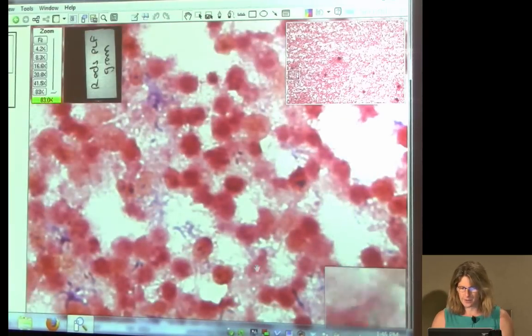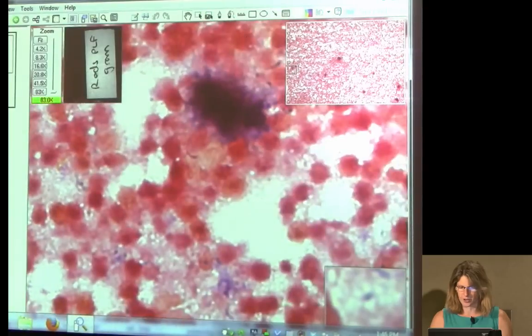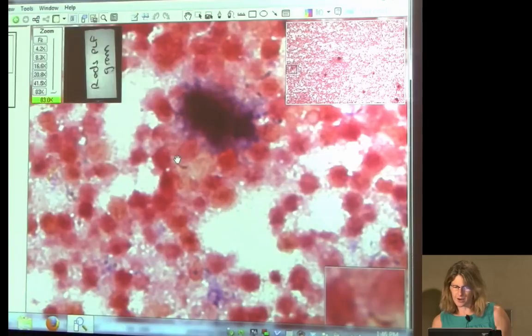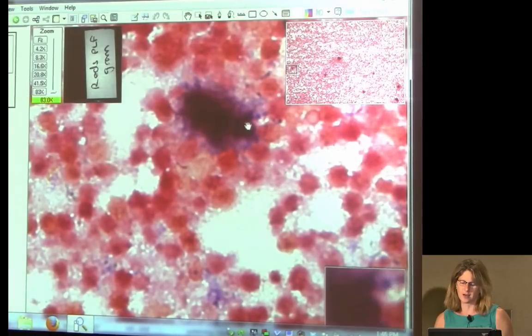And that's pretty typical morphologic features for Nocardia and Actinomyces. And here's another. So here you can see the bacteria coming off. They're often accompanied by gram-negative anaerobes, such as Fusobacterium and other species, and those often overgrow these organisms, and I know they're treated differently, so it's really important to look for them.